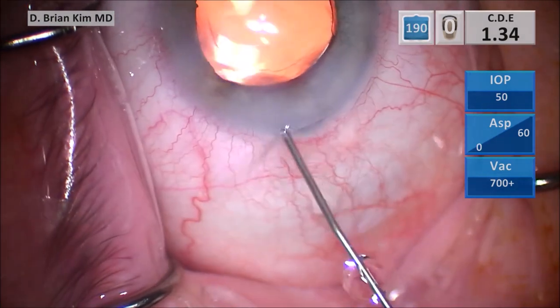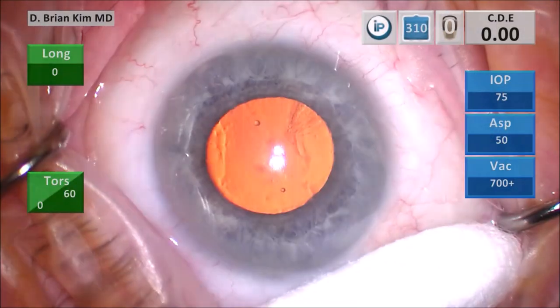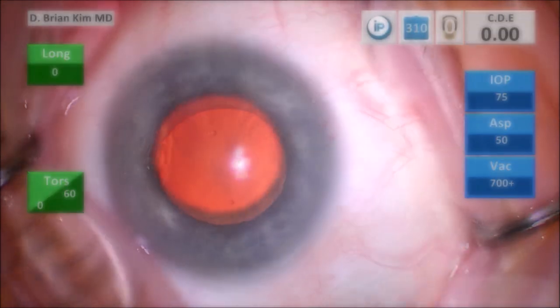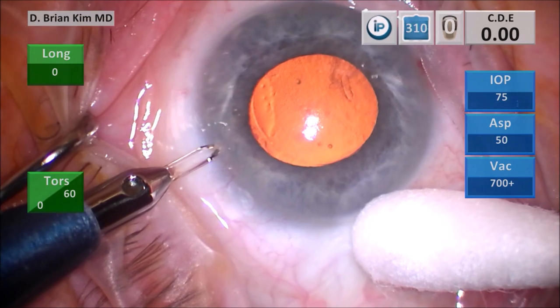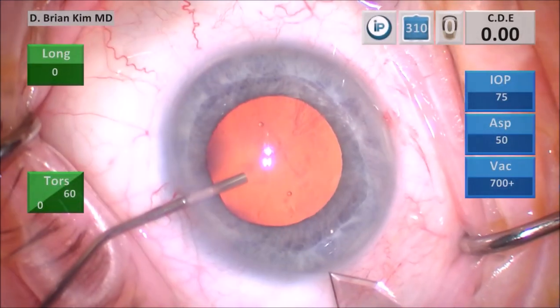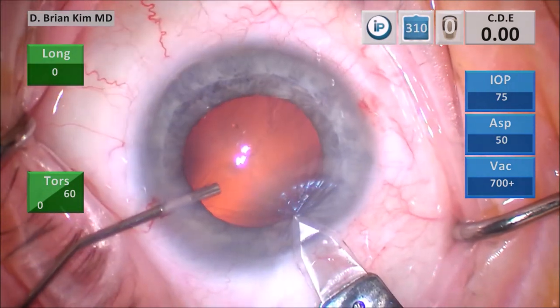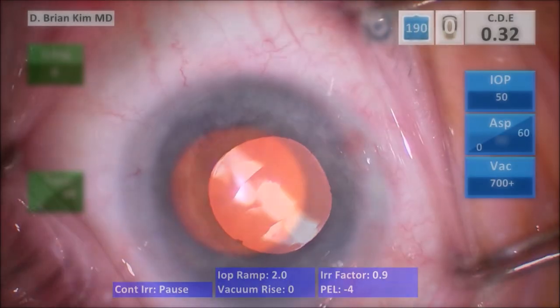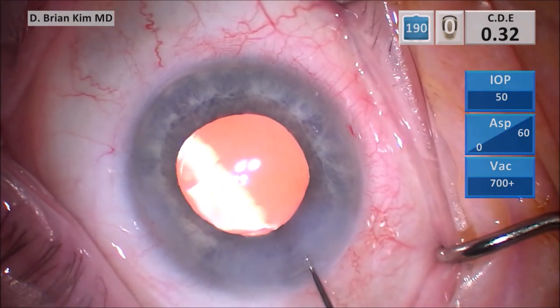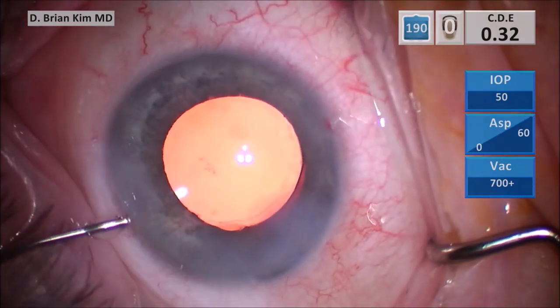Hydrate the side of the paracentesis as well as the roof of the paracentesis. Make sure your cannula pressure is firm and steady and not too vigorous that you might cause a complication. Here's yet another case: mark the central cornea, use a cotton tip to move the eye to the left for a flat approach on the paracentesis, getting a nice rectangular incision. Use a cotton tip to pull the eye to the right, staying near parallel to the iris plane — stay as flat as possible to get that nice rectangular incision. Fill the eye with viscoelastic, make a vertical groove, then with the blade tip going into the deepest part of the groove, tunnel through the corneal stroma and dive into the eye. At the end of the case, hydrate the right and left sides of the main incision, then turn the cannula upward and gently sweep side to side to get nice stromal hydration of the roof — being careful not to cause a Descemet's separation — then hydrate the side and roof of the paracentesis.